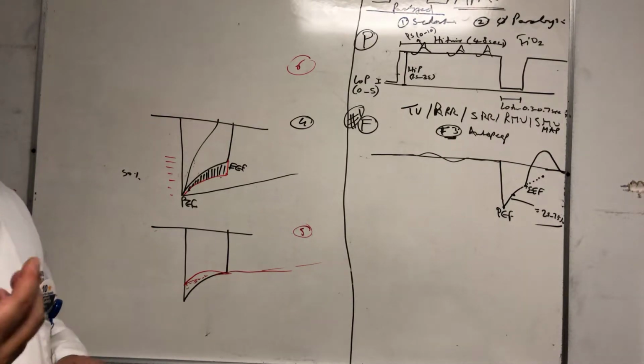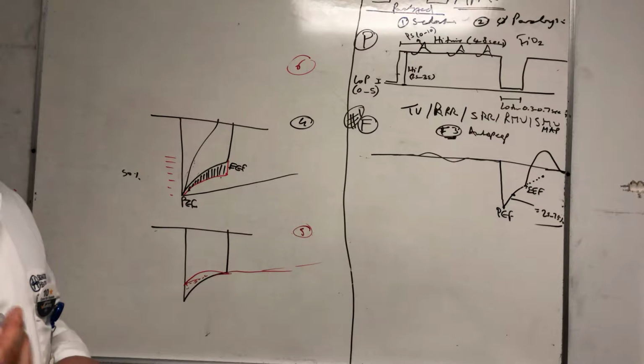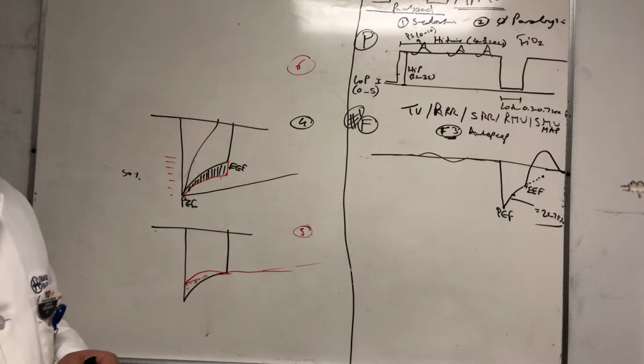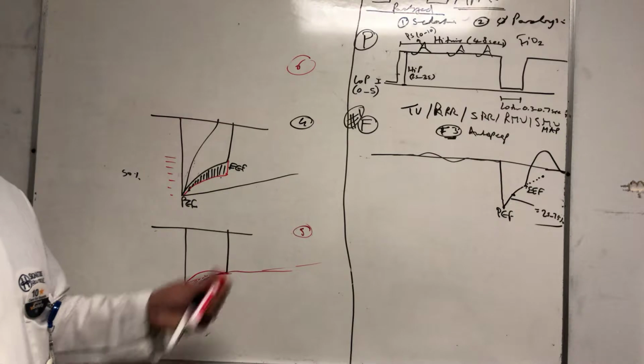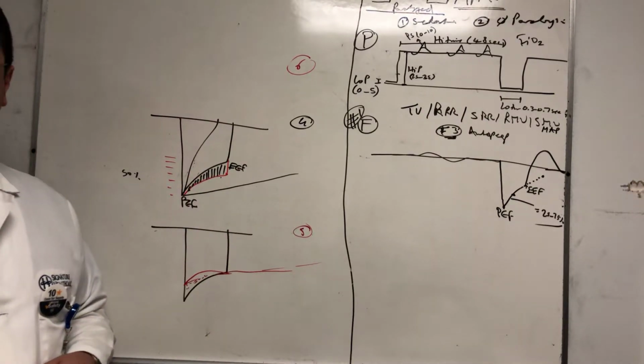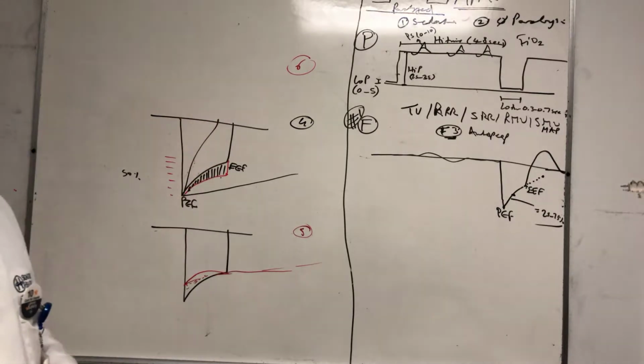Meaning, one of the age-long questions: you get somebody who's an ARDS patient, who's a COPD patient at baseline, and he has pneumonia and ARDS. Half of our patients are like this, right? So he has both. He has restrictive lung disease and obstructive lung disease together. Which one is at play? We don't know which one is at play. This will tell you which one is at play.